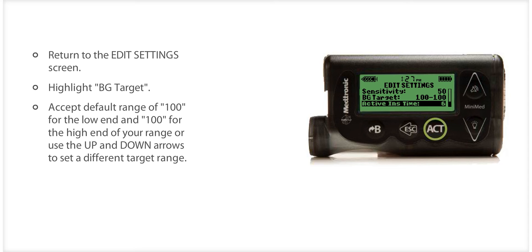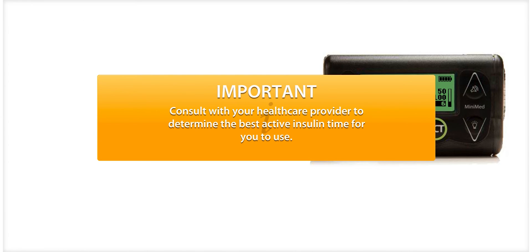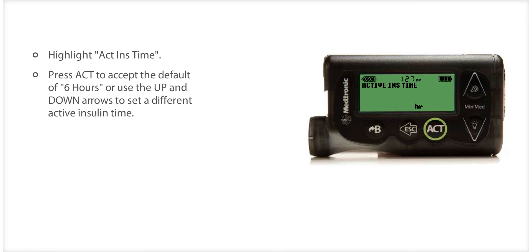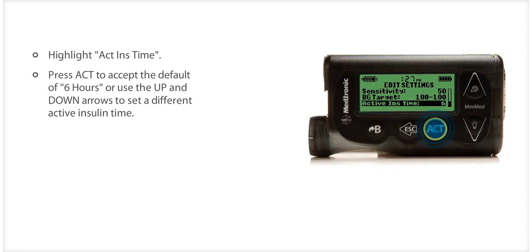Press ACT to return to the Edit Settings screen. The final information to enter is active insulin time. The Bolus Wizard feature uses the active insulin time to calculate the amount of active insulin that remains in your body from previous boluses, and then subtracts that amount from correction bolus insulin that you may need to give to correct a high blood sugar. Active insulin time is most commonly set at either five or six hours for adults. Please consult with your health care provider to determine the best active insulin time for you. To set active insulin time, select Active Insulin Time on the Edit Settings screen and press ACT. You will see 6 flashing on the screen. If you wish to change the active insulin time, use the up or down arrows, set the number of hours, and press ACT again.